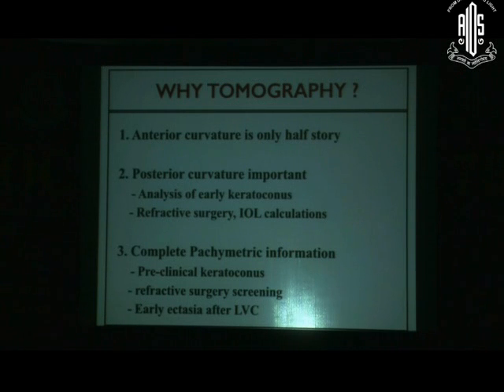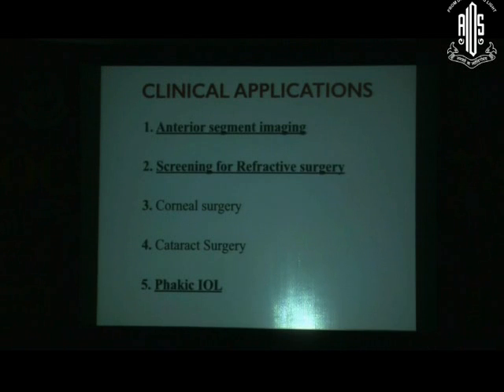Now, the complete pachymetric information definitely helps for following up preclinical keratoconus cases, for refractive surgery screening, and for early ectasia after laser vision correction. So we have a wide range of clinical applications with this device, but we are concentrating only on anterior segment imaging, screening for refractive surgery, and phakic IOL.